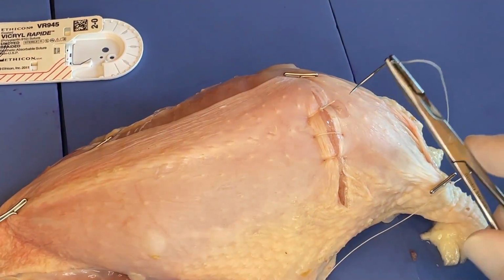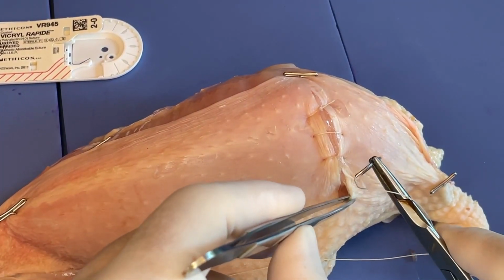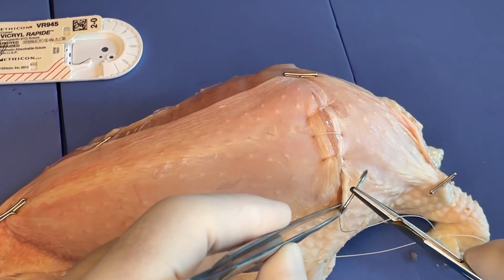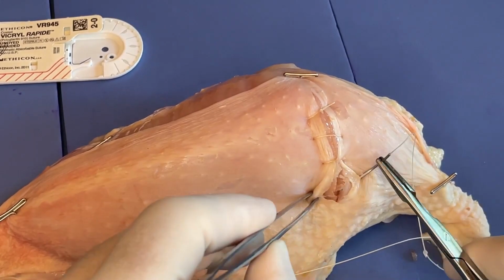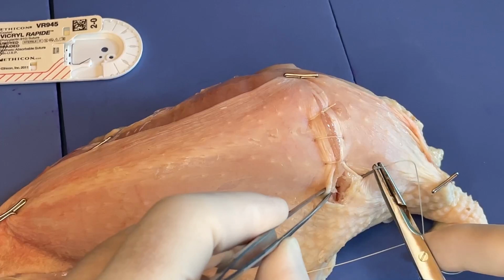All right, so that's just simple interrupted. And again, we want to get the needle attacking the tissue perpendicularly. We don't want it to really slide into it unless we're taking a very, very superficial bite, but we really want the needle to be at a right angle to the tissue, and then as soon as you poke in, start to rotate your wrist. That way you don't go too deep. Come out, and at least visualize the needle in the middle of the tissue.